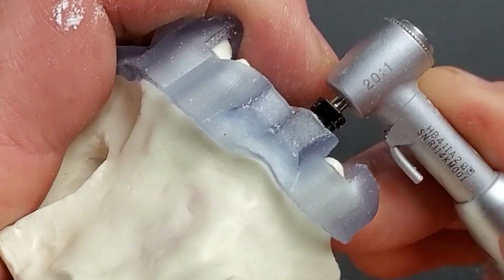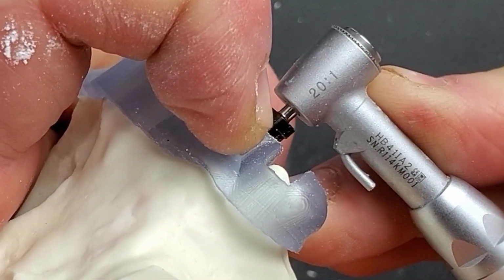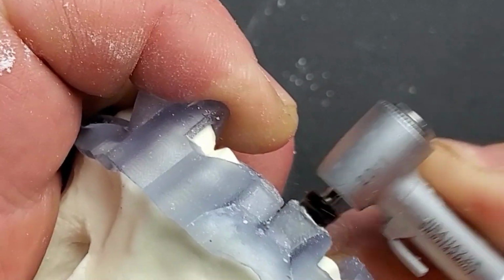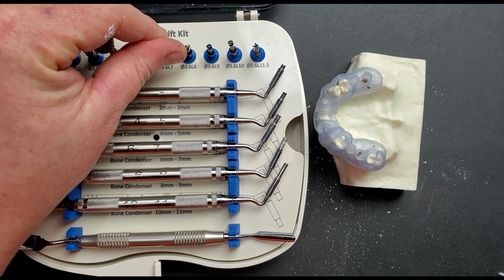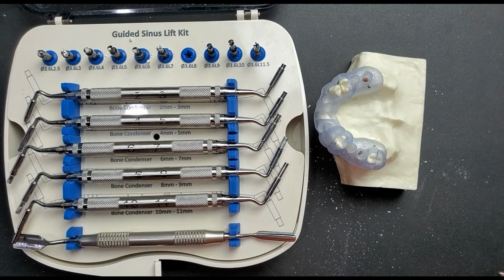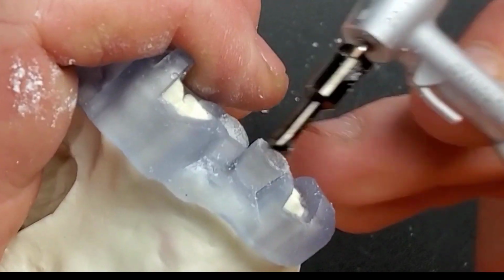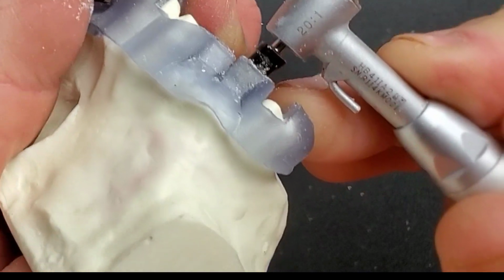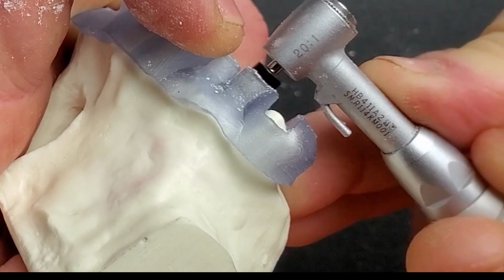Okay, so here again, it looks like there's bone ahead of me because there is still a gap right here between the drill stop and the guide tube. So I'll step on the pedal, go another millimeter deep. Now we're going to break through at some point within the next drill or two. So I'm just going really carefully to make sure that we're not going to put excessive pressure on the membrane. All right, here again, I've still got bone ahead of me because the drill does not go all the way to seat. So step on the pedal.